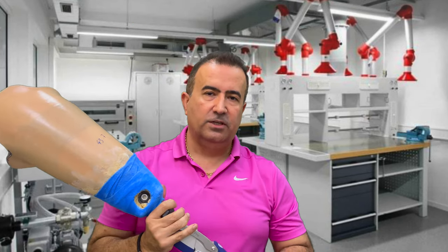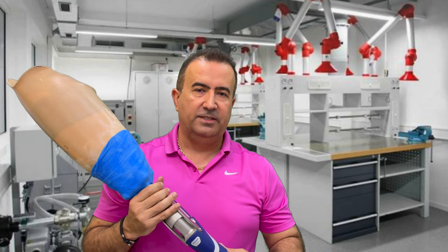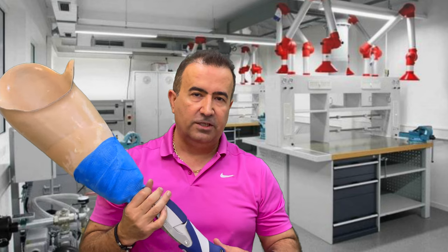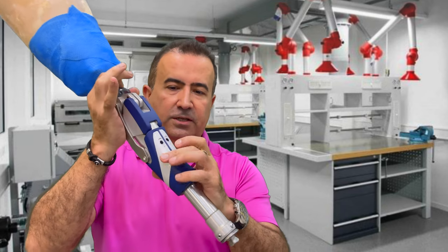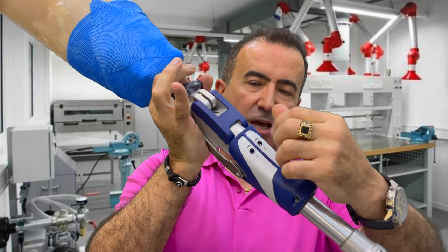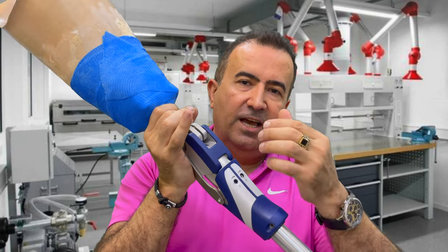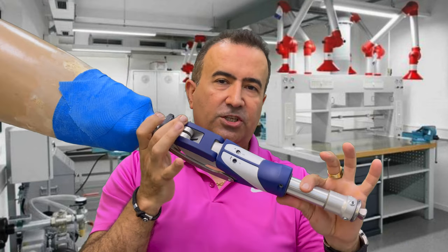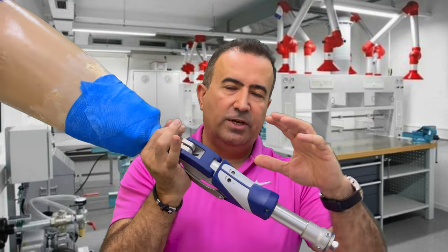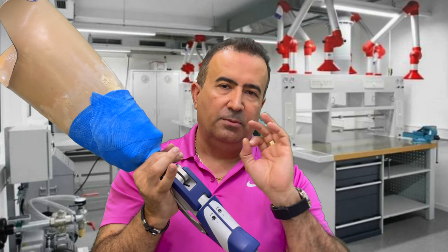Another very important point: when you are doing the first trial for the prosthetic with 3R106 Pro, it's always important, as you can see here, that these two extension and flexion settings are turned to zero, the factory setting. According to the patient's condition and how he is walking, you can adjust it to find out the best possible and suitable setting for the patient, as you can see in following videos.